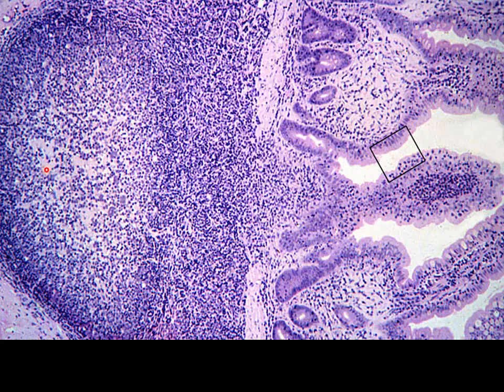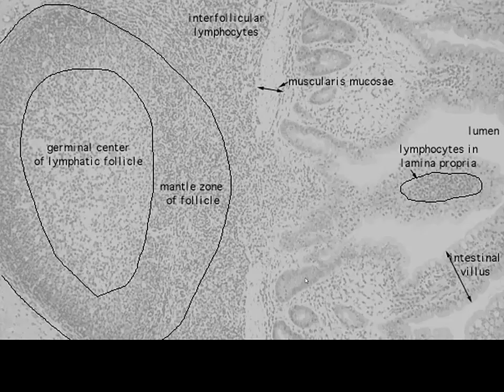Now, here we have one of the nodules of Peyer's patches, and you can see the lymphocytic infiltrate of the lymphocytes extending up into the epithelium and up into these intestinal villi as they're projecting up there. We can see all of these hollowed out spaces here. Our goblet cells, you're probably familiar with that, our columnar epithelium. So you should be pretty comfortable already with much of what we're going to talk about with gastrointestinal tract when we get there.